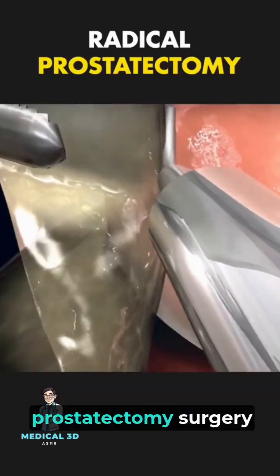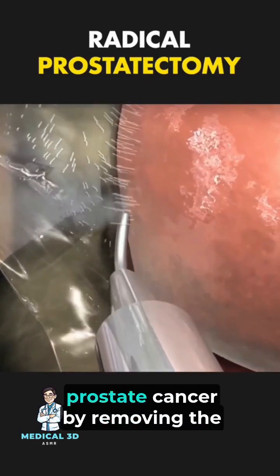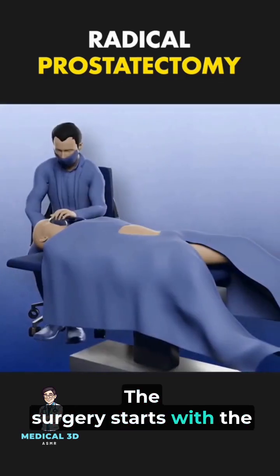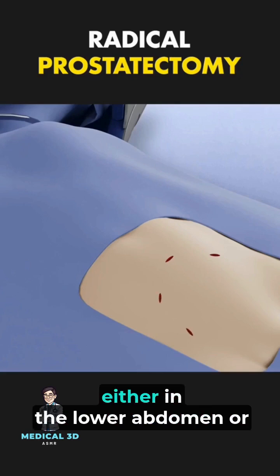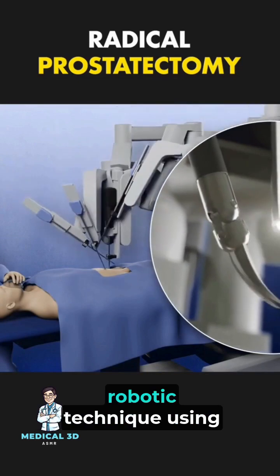Ever wondered how radical prostatectomy surgery is performed? It's a procedure used to treat prostate cancer by removing the entire prostate gland and nearby tissues. The surgery starts with the patient under anesthesia to ensure they feel no pain. The surgeon makes an incision, either in the lower abdomen or through a minimally invasive robotic technique.